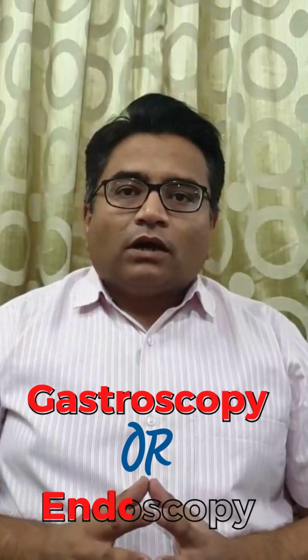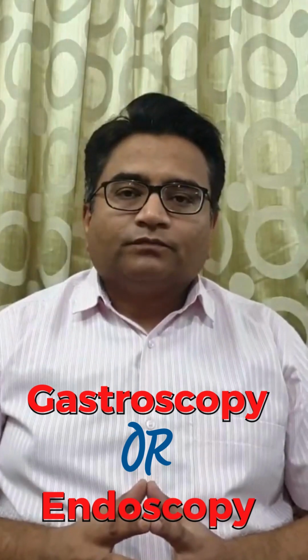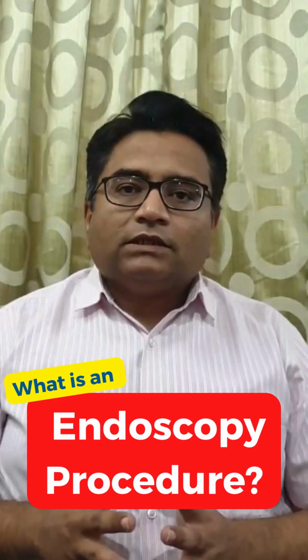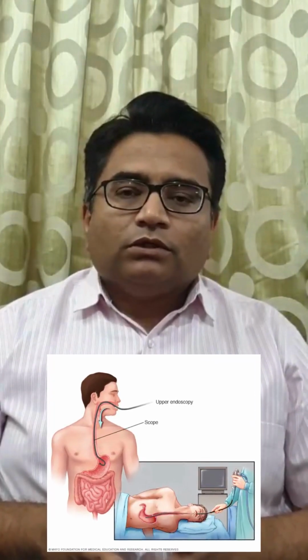Today we are going to talk about gastroscopy or an upper GI scopy, or what is in layman's term called the endoscopy. So what is an endoscopic procedure? Basically it is the examination of the pharynx, esophagus, stomach and the first 20 centimeters of the small intestine, that is called the duodenum. A small tube which has a camera at its end is passed through the mouth into the stomach to observe the inner skin or the mucous membrane of the stomach, esophagus and the duodenum.